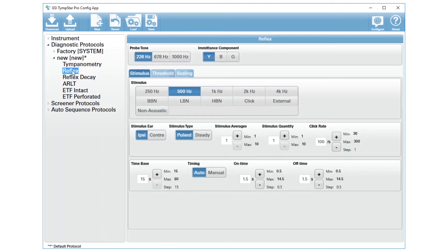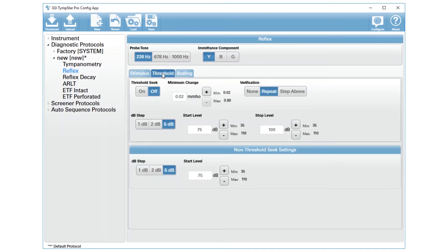When we talk about reflex, we have the stimulus, the threshold, and the scaling. We're talking about reflex threshold, so we're going to select that.